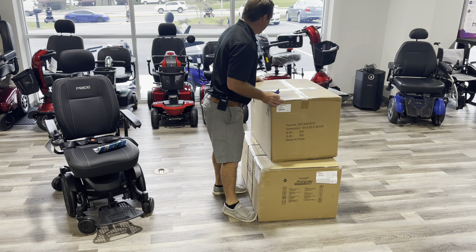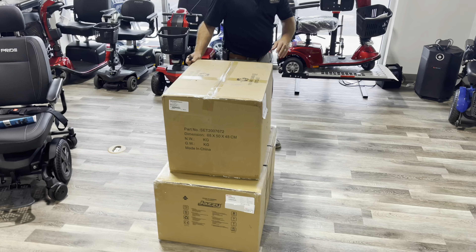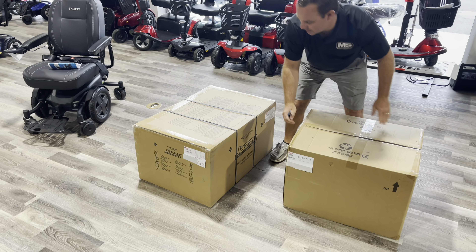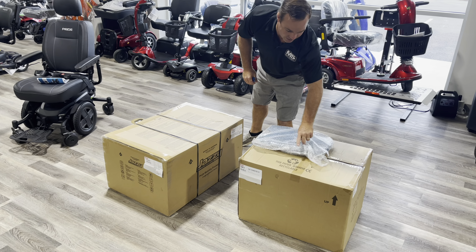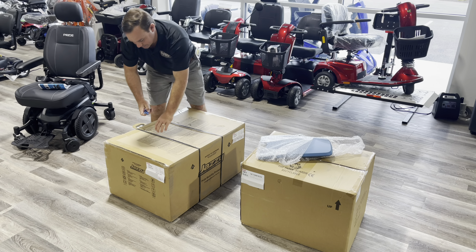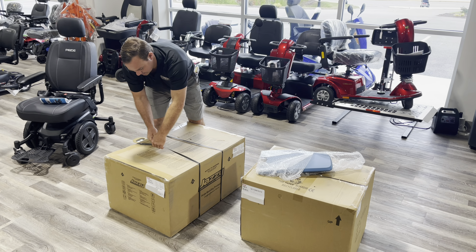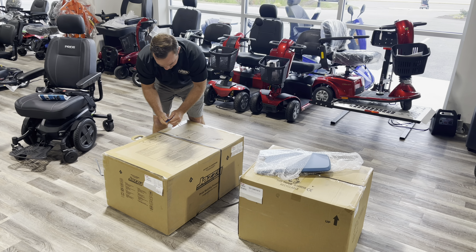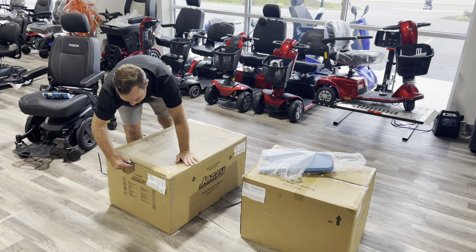It'll come on a pallet. This is the seat, so what we're going to do for this video is just take the seat off. This seat's about 40-something pounds. I already got the shroud - this is a blue, there's like five or six different colors. I'm going to do the unboxing because your manual will be in here and some things you'll need for the seat. You can use just a regular pair of scissors. I'm using a box cutter razor blade.